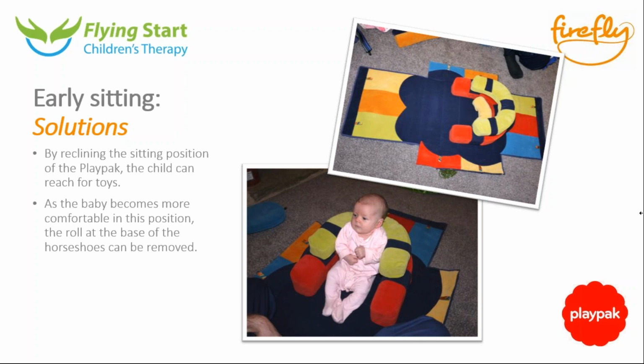On the top picture there, you can see there's a roll at the bottom horseshoe, which almost supports the bottom and the pelvis in a forwards position, so that it opens up the pelvis a bit. It puts them in a reclined sitting position, but their shoulders are still nicely supported, as you can see in the bottom picture, which helps them get that head control to then look forwards to you and left and right to toys and things.